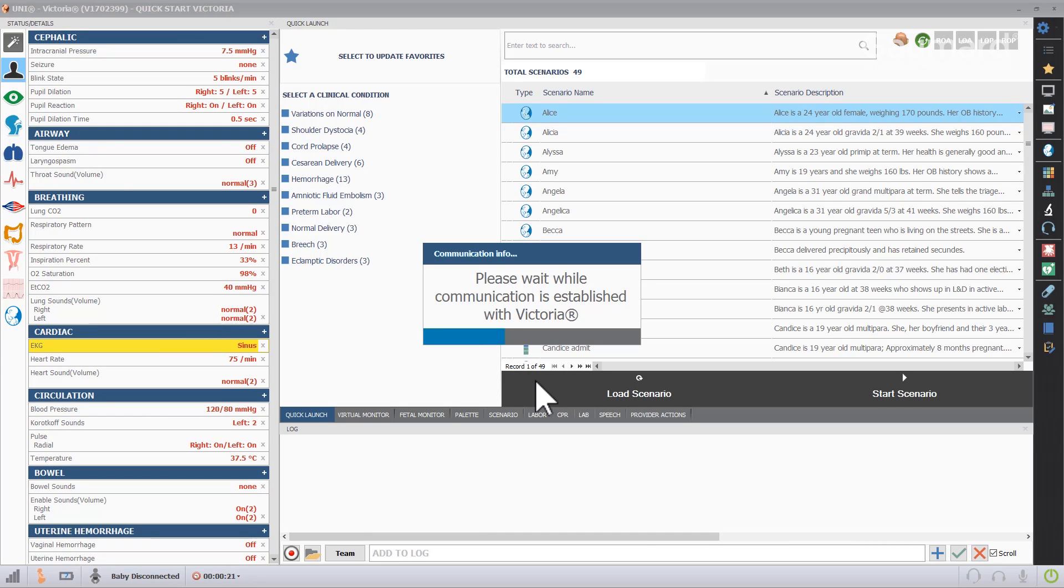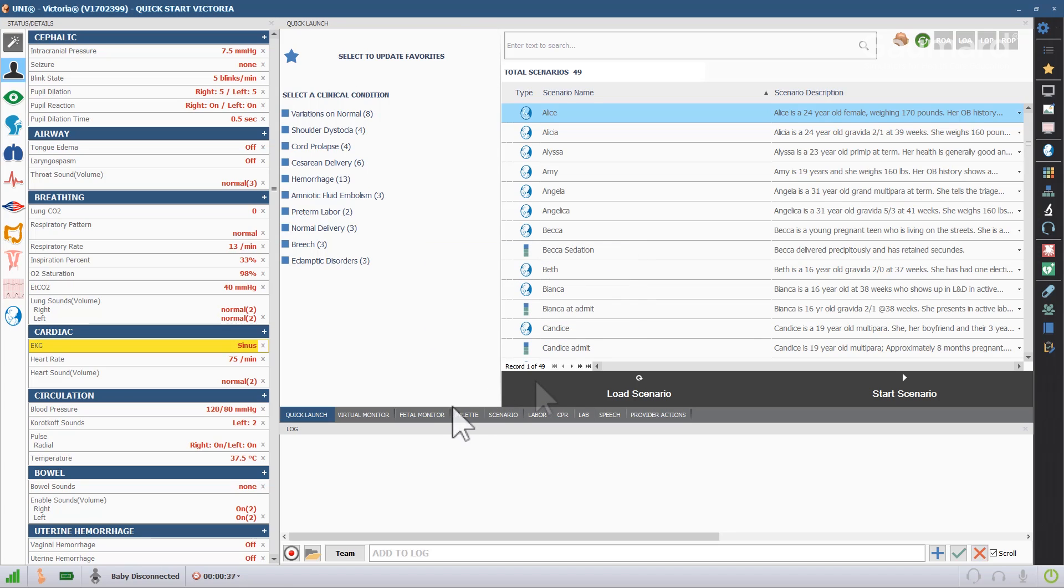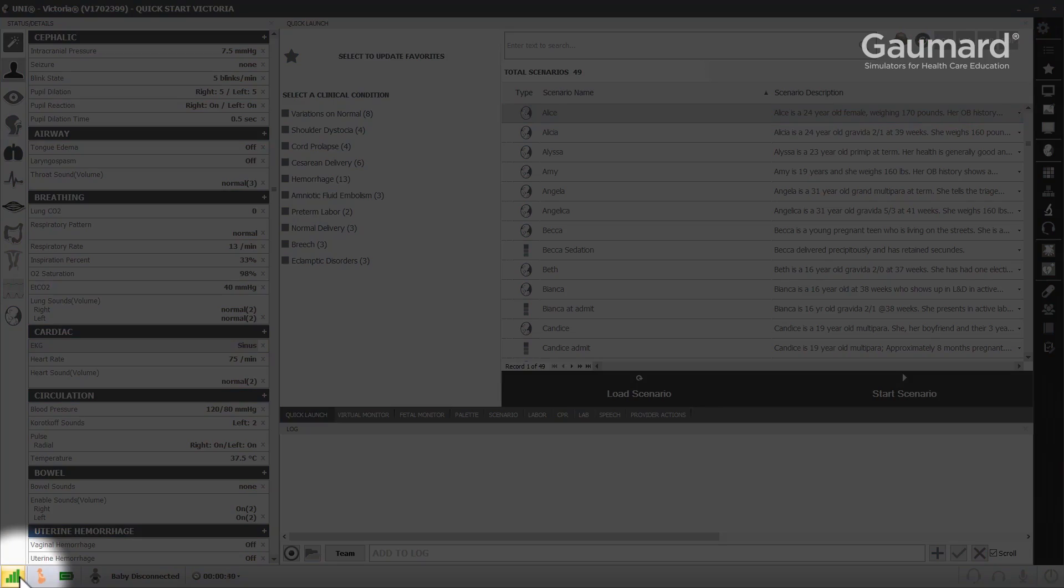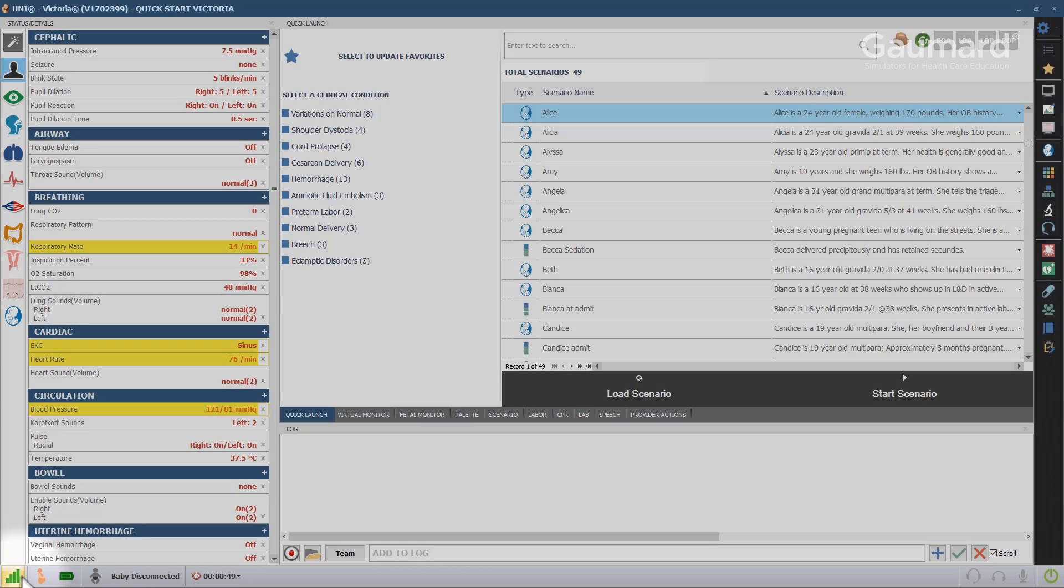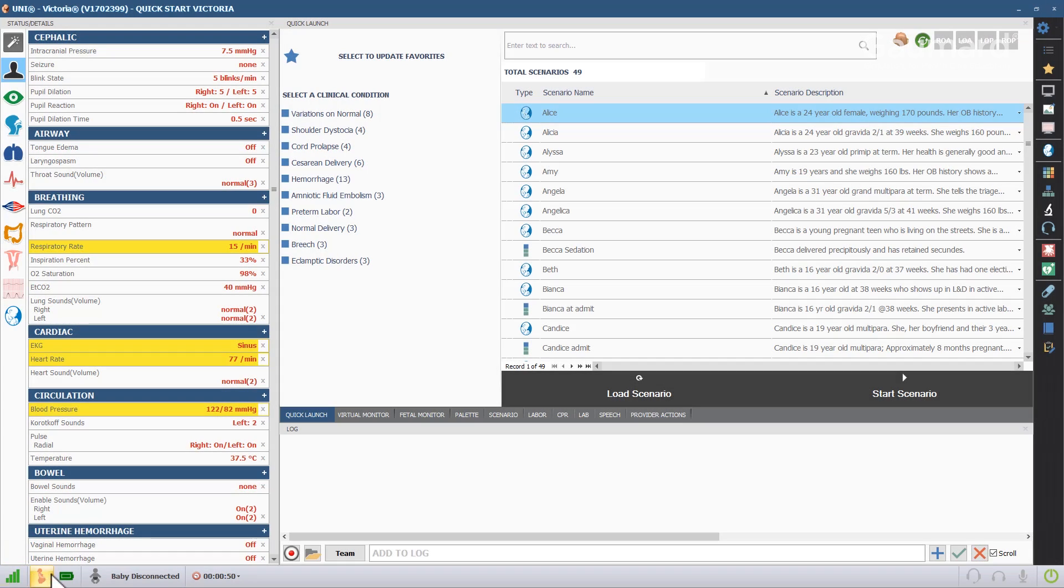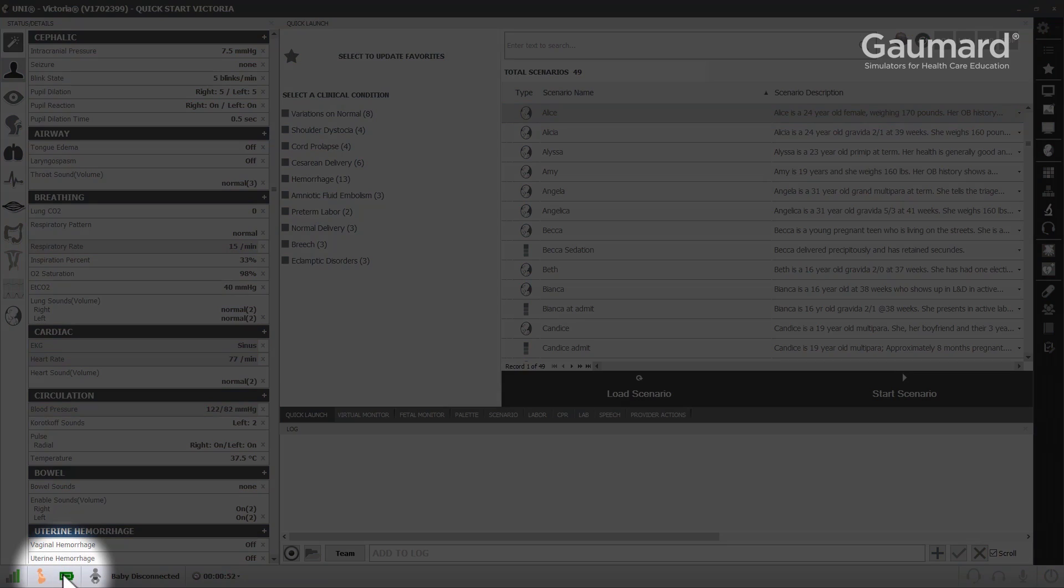The software will automatically connect to the simulator with the matching serial number. The strength of the connection is displayed in the lower left corner of the screen. The battery level is displayed next to the strength of the connection. Victoria can be operated on battery power for approximately 10 hours depending on the number of features used.